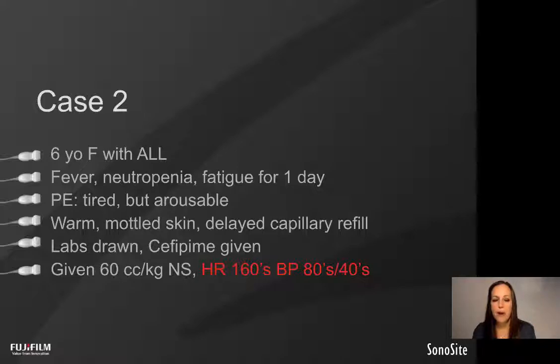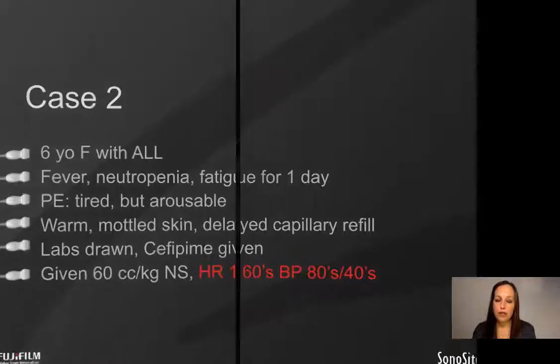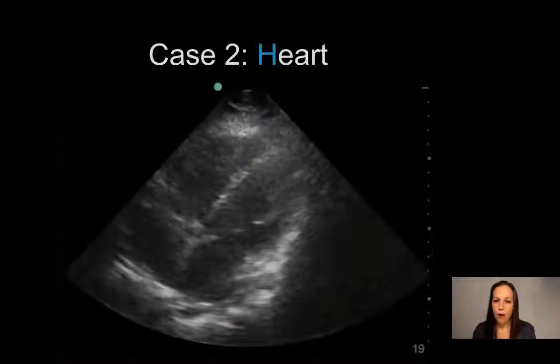Now, it is important to note that for all patients who come in, I don't perform a RUSH protocol on them. Otherwise, I would be performing way too many ultrasounds on my patients and delaying their care. If they look good and I'm giving them fluid and they're responding, I don't necessarily need to do the RUSH protocol. However, in this case, we've already given this patient a sufficient amount of fluids, but she's still tachycardic and hypotensive. So then it becomes very useful to use the RUSH protocol.